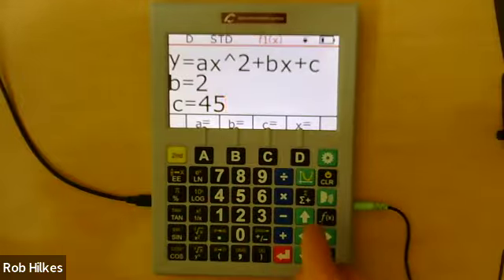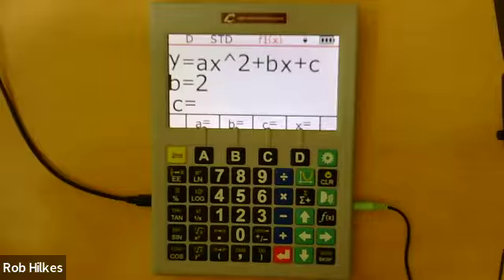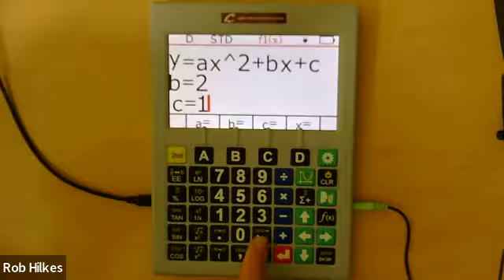No, you know what? I'm going to change that. That's too complicated for now. So if I want to change something, I just hit the backspace, which is this bottom right key, and I can edit that. I can make it anything I want, and I'll make it -1. So I can enter -1 by saying -1, or I can say 1 and then hit this change sign key, the plus minus. Okay, and then enter.